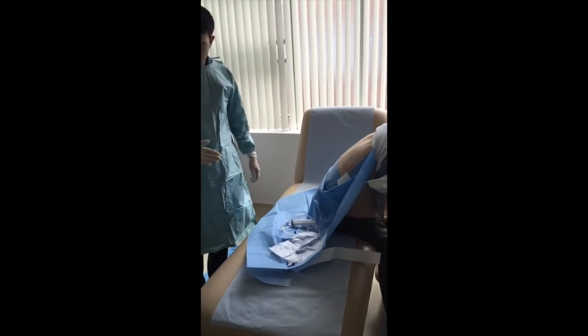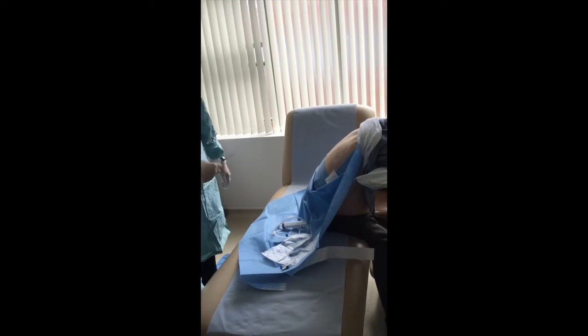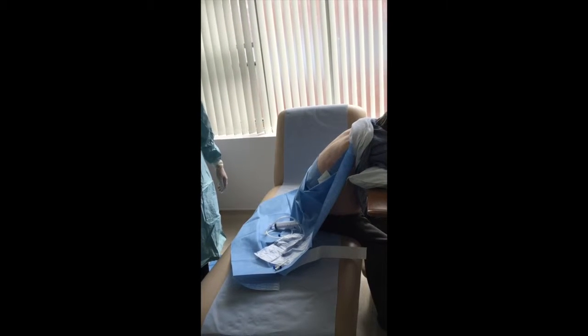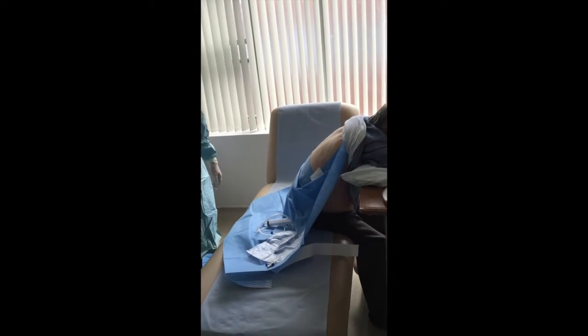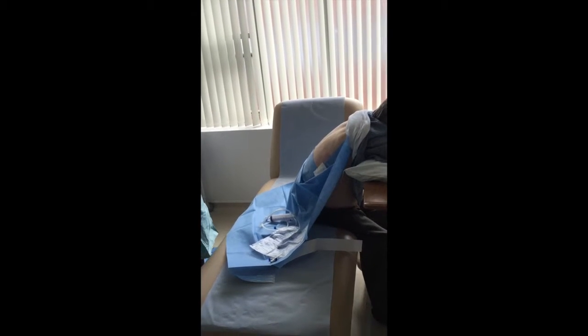Now what you're going to do, because you've probably got a really good local anaesthetic effect now, because you've taken a few minutes to set this up, you're going to try and get some fluid back. Let's just get rid of a bit of that fluid here. And you're going to go in at the same depth and the same angle that you went in before. So just do exactly the same.